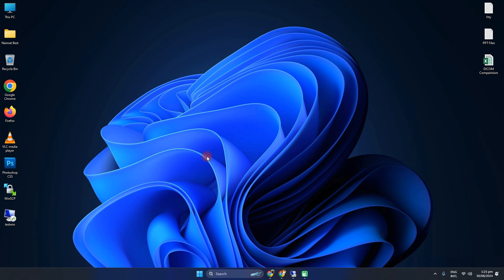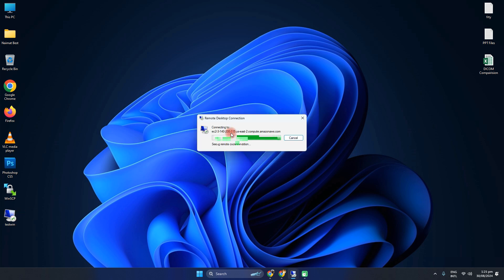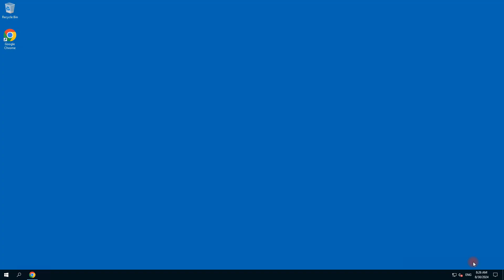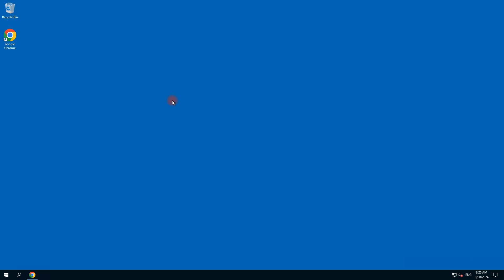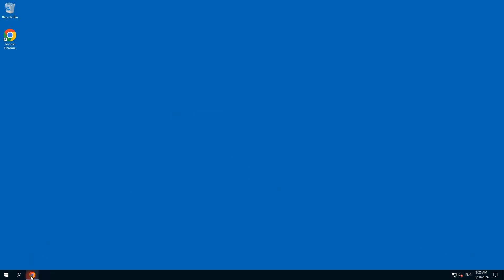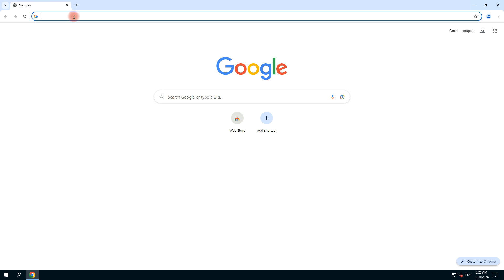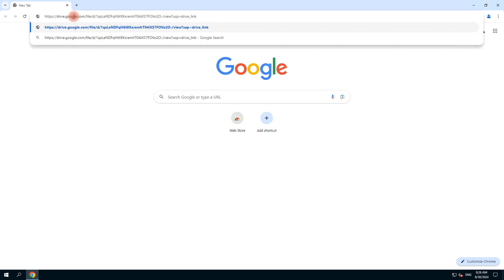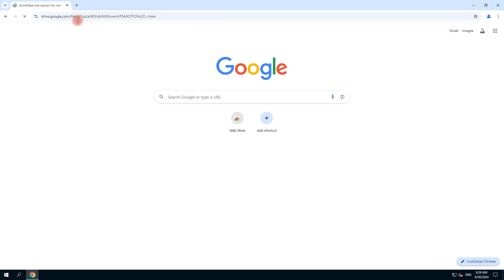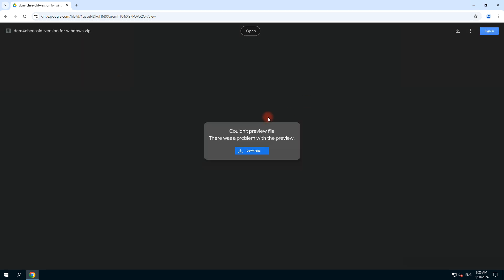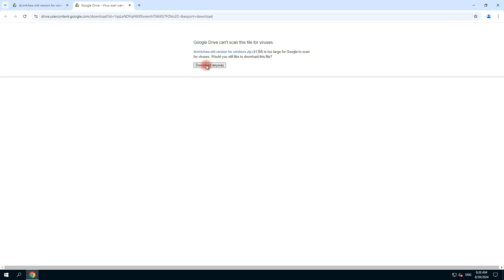First of all, connect to the virtual machine where we need to install DCM4CHEE. After connecting your virtual machine, open the Chrome browser. I have a link to the complete zip file — I will share this link in the video description. You can download this complete zip file and click download, download anyway.